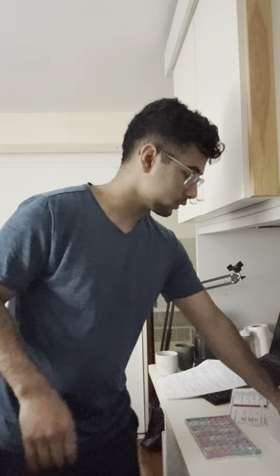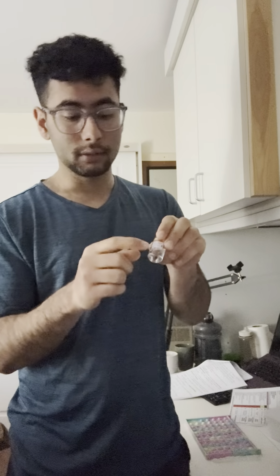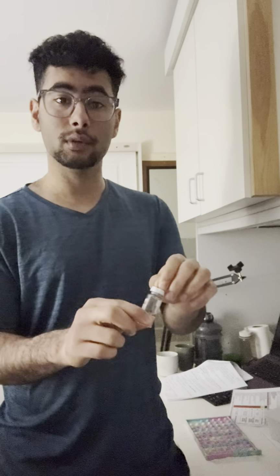Now, this is the ceftriaxone. This is an antibiotic. There is some powder in it and we're going to mix it with water. How do we know how much we are giving? You have to look up the Australian Injectable Drugs Handbook, which tells us the concentration and how much medication we are giving, and we look it up on the computer. I know this because I have practiced in my uni. Normally there is powder and we mix it with water or 0.9 saline solution.